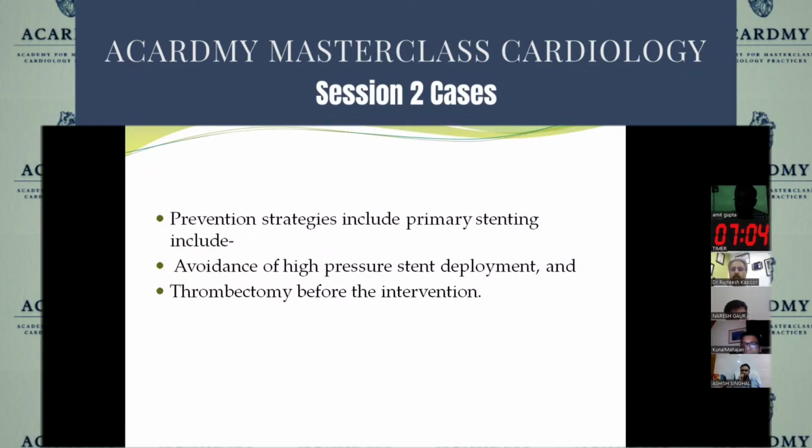As per my experience, I can give a few statements where we can avoid such things. One, if the artery is 100% occluded, although the data is not fully supporting the use of export catheters, I think export catheters still do a lot of benefit in such vessels. If the artery is flowing, I'm clear that it's not giving much benefit. So in 100% occluded arteries, thrombus burden is higher. We should use export and then start the procedure. Even if it removes a 20% chunk of the thrombus, it's going to benefit the patient a lot in terms of vessel flow.